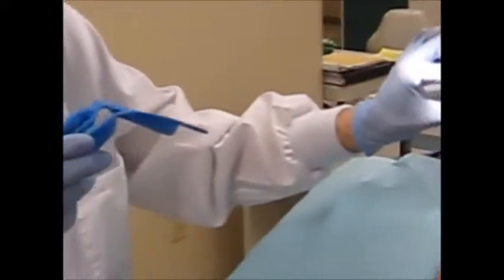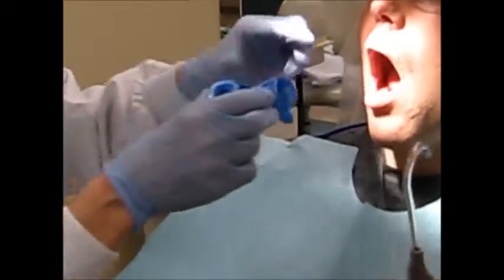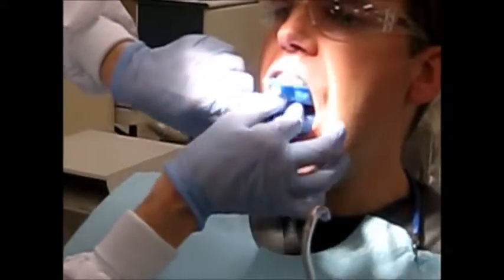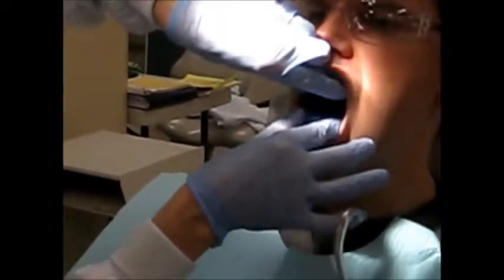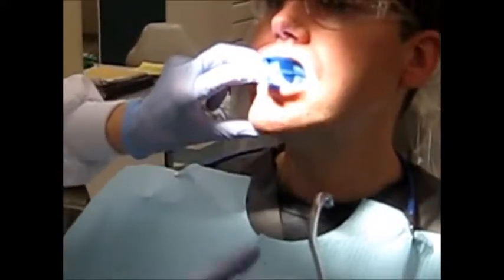I will obtain the tray. I'll ask the patient to remove the saliva ejector for a moment, bending the tray in half with the maxillary arch pointed upward. I'll seat the tray, again making sure that it fits over everything with your fingers, and have the patient tap up and down to allow the fluoride to flow.